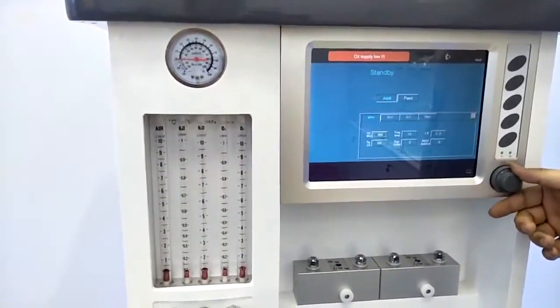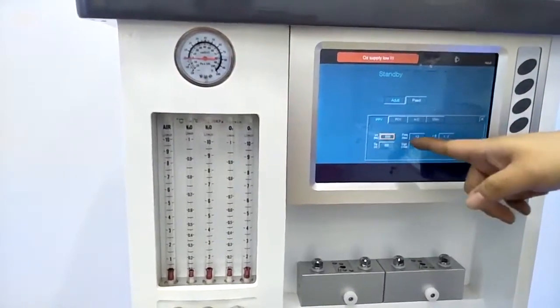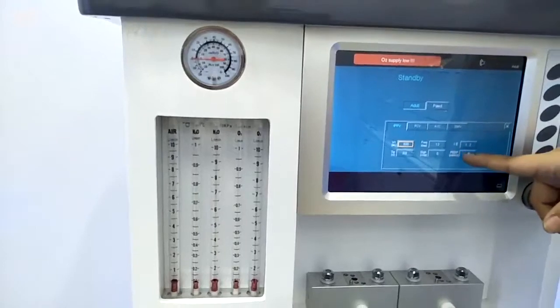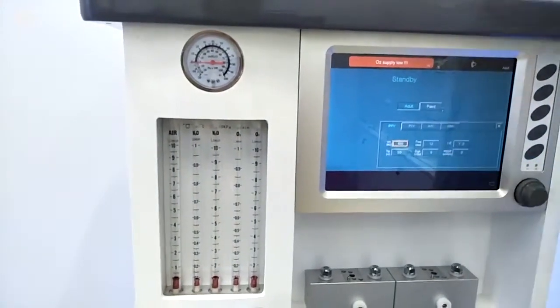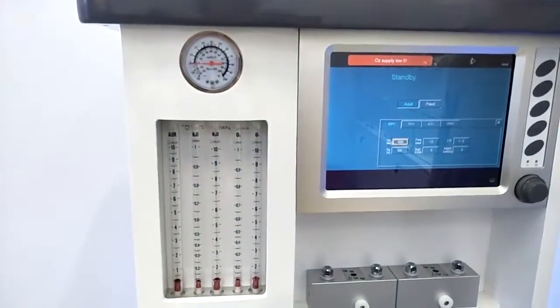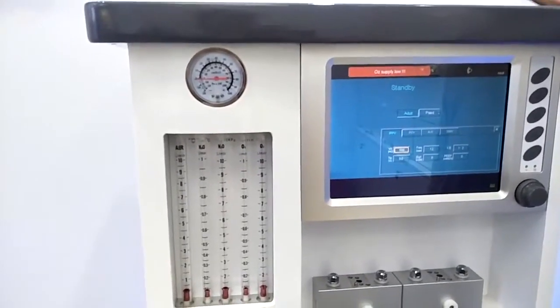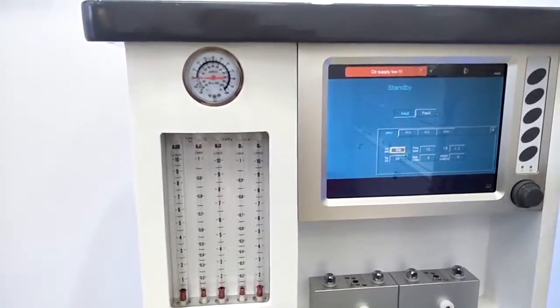Under each of the ventilation modes, we can check the tidal volume, frequency, IE ratio, time, and also sigh and PEEP. For the sigh, it's also a special ventilation mode for our machine, because we know for normal people, after a long time breathing, they will have a long breath, so it can make the patient much more comfortable.